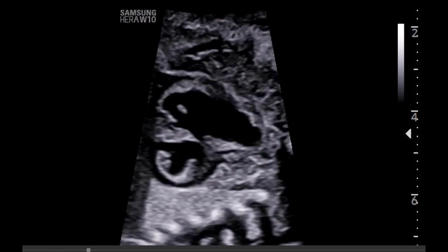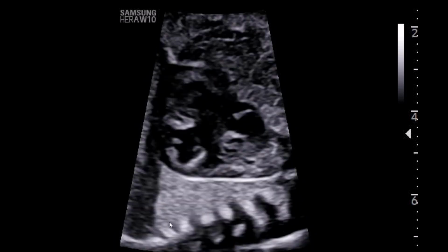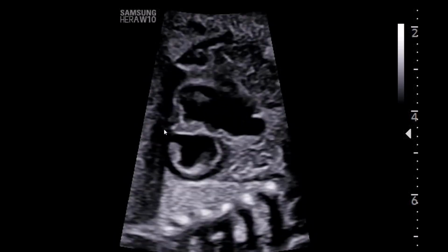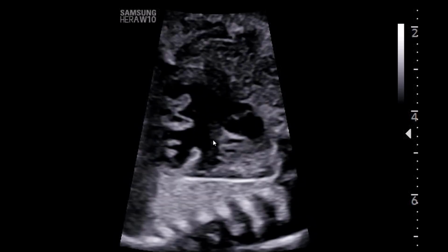Now, as we transition to our sagittal views through the fetus, we start to see spine posteriorly here, and this is a really nice short axis view of the ventricles. And at the end of that sweep, you can see more toward the base of the heart, this large subarterial VSD, this large posterior malalignment VSD.